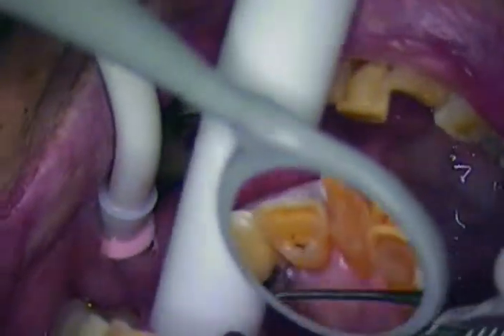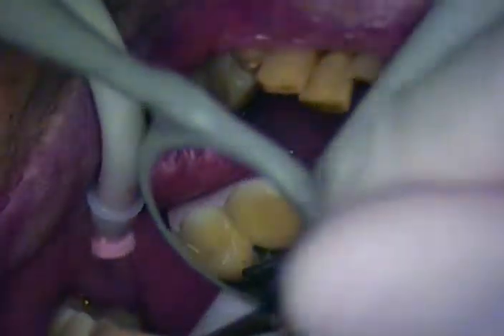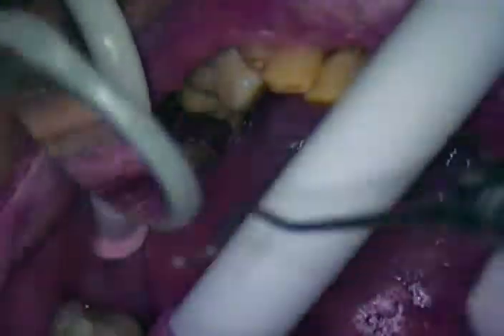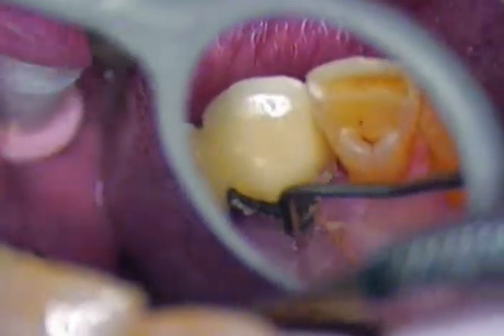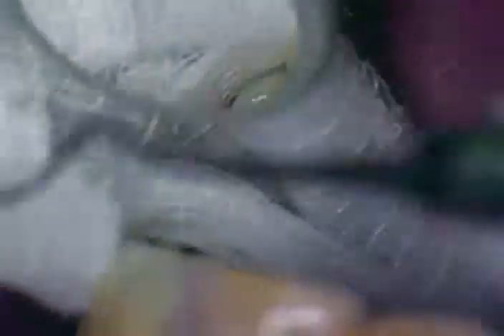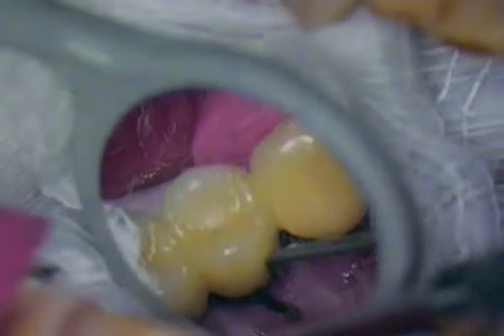Since we are using a microscope, I'm going to change magnification as I get closer and closer to the head of the abutments. Let's put a two-by-two gauze underneath — here's our margin, here's our margin. Put the gauze in just to catch any excess. We'll take a long explorer now.